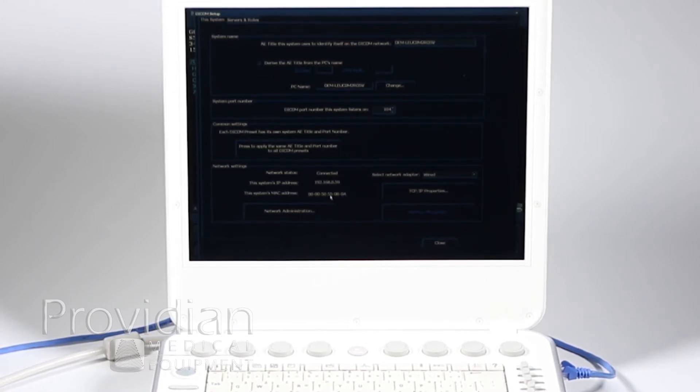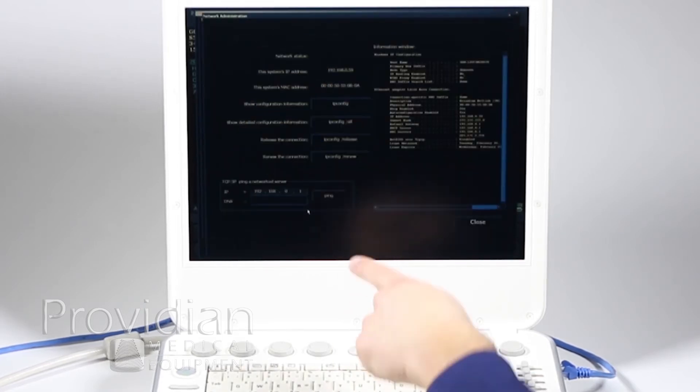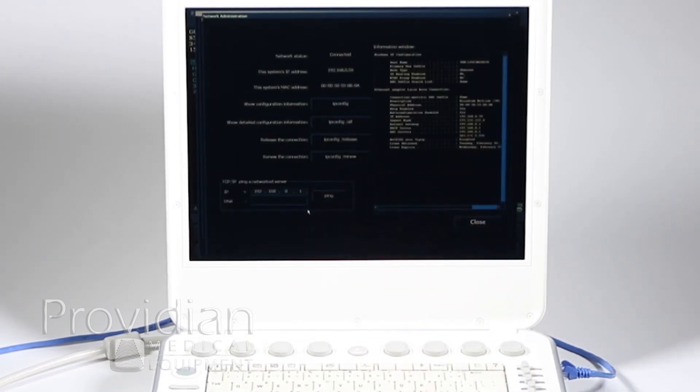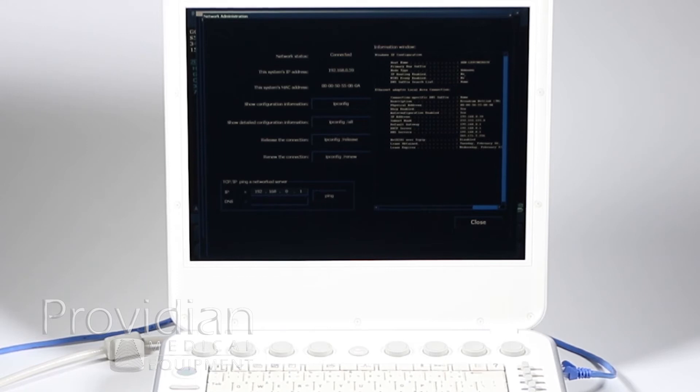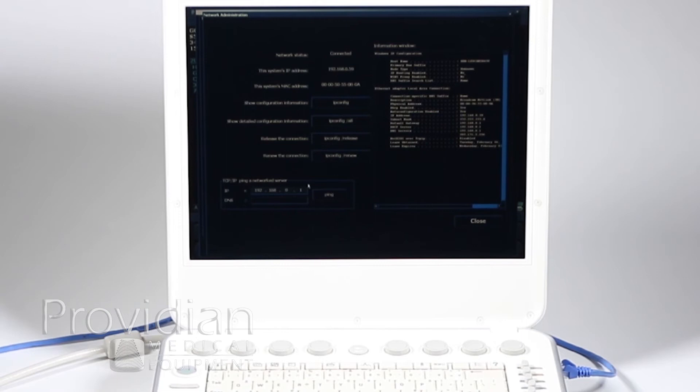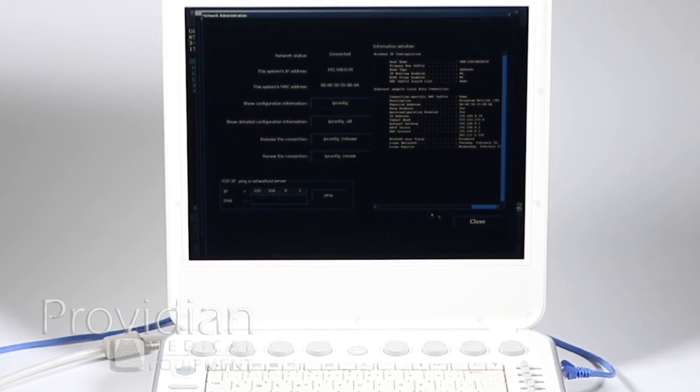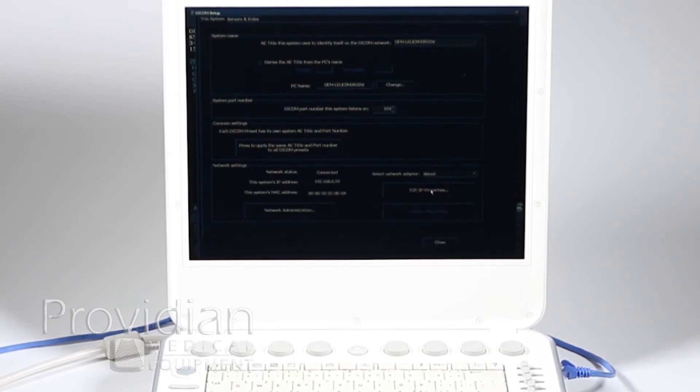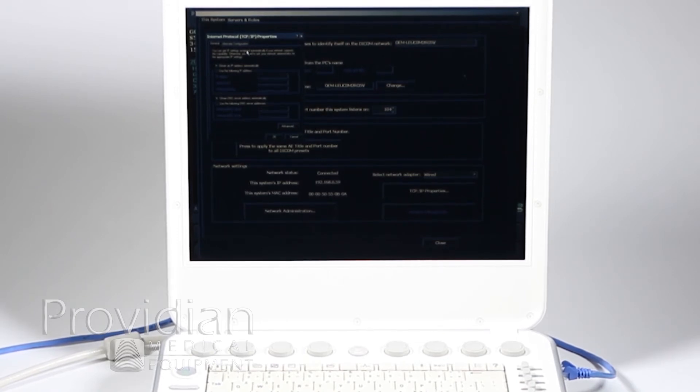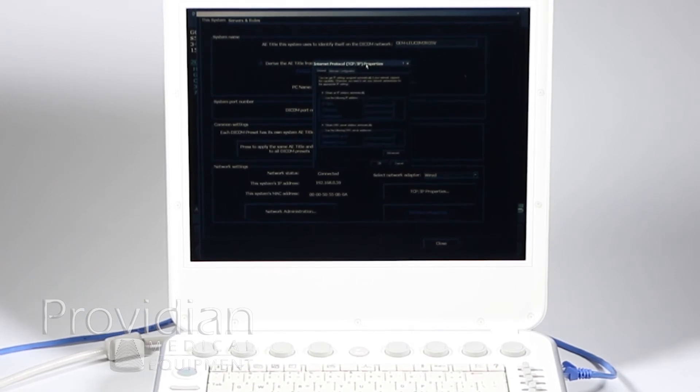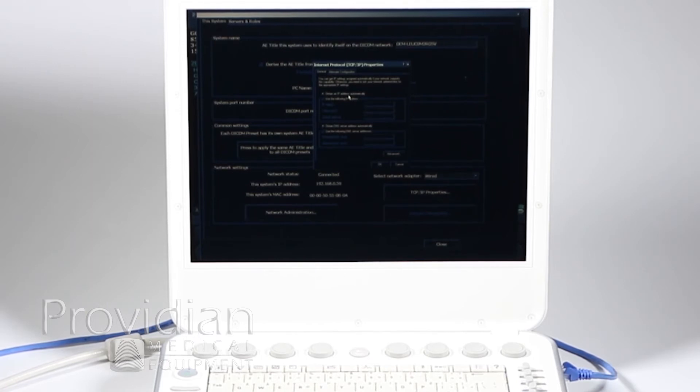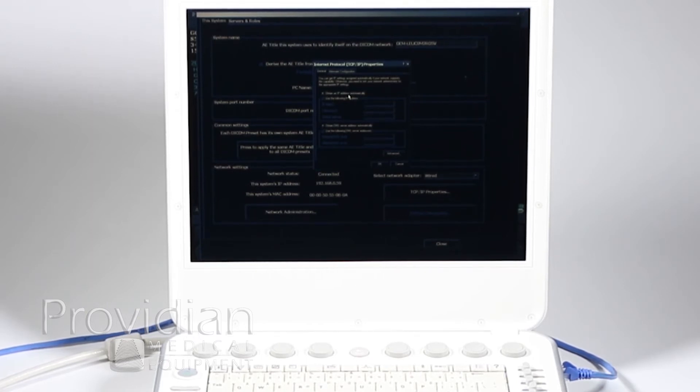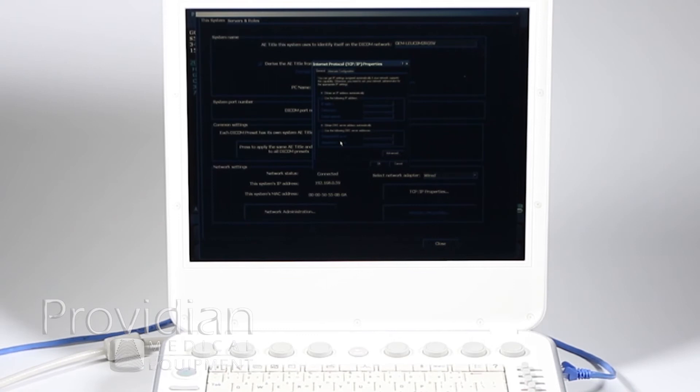You really want to jump straight to the bottom where we have our network settings. My network status says connected. I'm connected via Ethernet. I have DHCP and all that. My system has an IP address, meaning it's on my network. Here's the MAC address. If you're in a hospital, they may ask you that too. If I want to change any of that or enter a static IP, I'm going to click on that network administration. Here it's going to tell me everything about my network. It looks like a command prompt screen. If I want to test that network, here's where I want to ping it, make sure I'm connected.